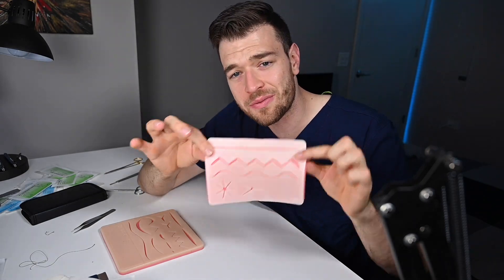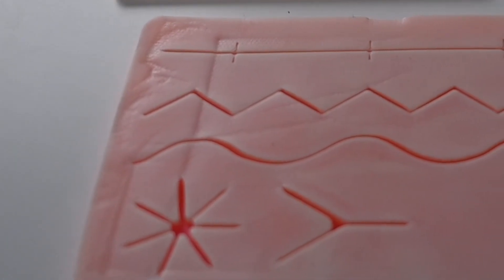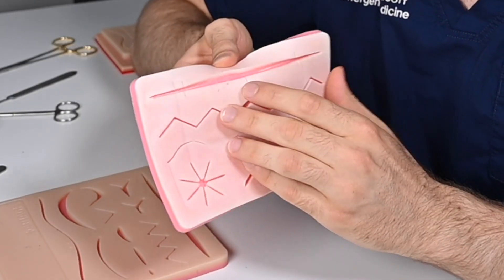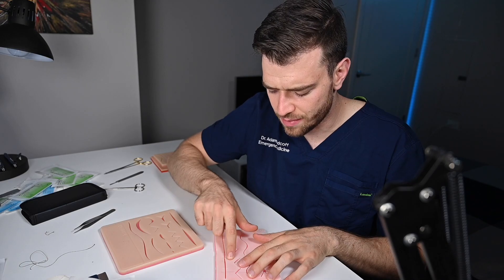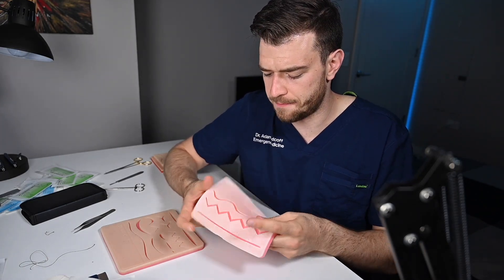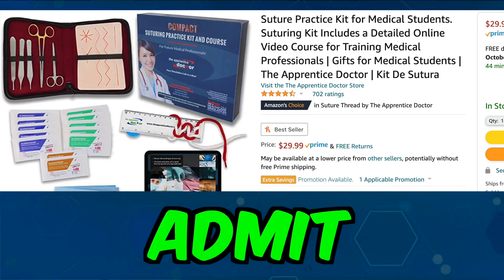Next up, the Apprentice Doctor Suture Pad. I actually think it's a really good pad. This laceration is really nice. The mesh layer is not right on the top, so if you cut with this it still has some feel. Making your own is a little bit more difficult with the mesh in there, but I like this pad. What would I give it overall? Honestly? Admit. I like this.